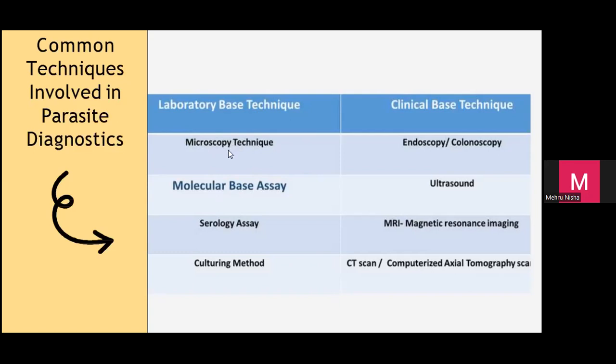Kalau Giardia? Giardia duodenalis. Dah belajar kan Giardia? Giardia ni dua boleh lah. Microscopy atau molecular. Serology also can. Tapi kit dia tak famous sangat. Culturing not lah. Usually kalau Giardia, kalau trophozoite senang tengok di mikroskop. Kalau cyst, kadang-kadang kita confuse dengan lain artifact ke. So you can rajin lah buat molecular assay to confirm. Okay, that is the thing.